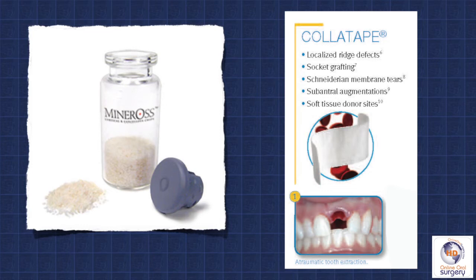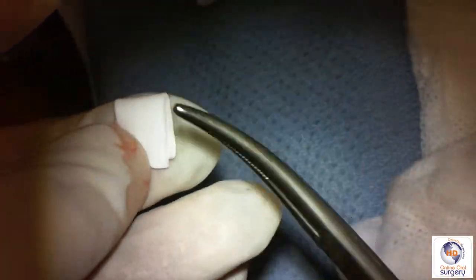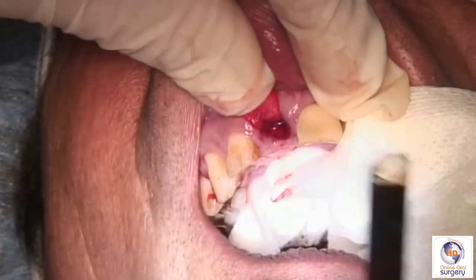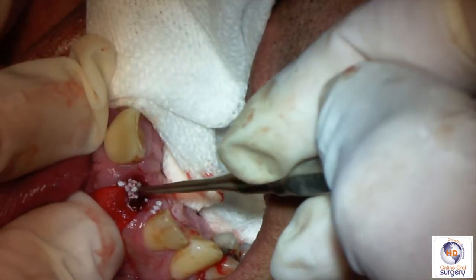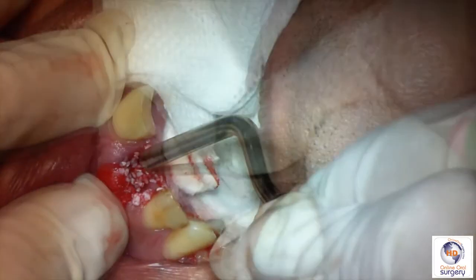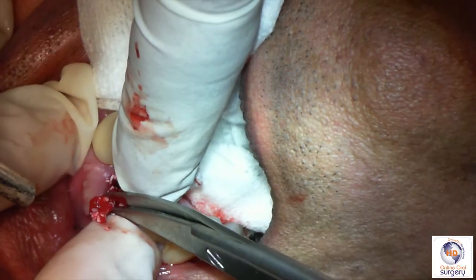To fill in the space between the alveolus and the implant, I'm going to use some Mineros, which is a freeze-dried mineralized corticocancellous particulate bone graft. We're going to mix that with some saline and pack it into place around the implant. We also have to deal with the buccal alveolar mucosal defect, so we're going to place a double layer of collotape — a collagen dressing — under the periosteum, between the mucosa and the alveolar bone. I take a small piece of collotape, fold it in half, and using a small hemostat place it under the periosteal layer just buccal to the alveolus. Then I pack it in place with a small curved curette. Once it's in position, we go ahead and pack the bone — packing in the Mineros with a very light, gentle pressure to fill in the spaces.